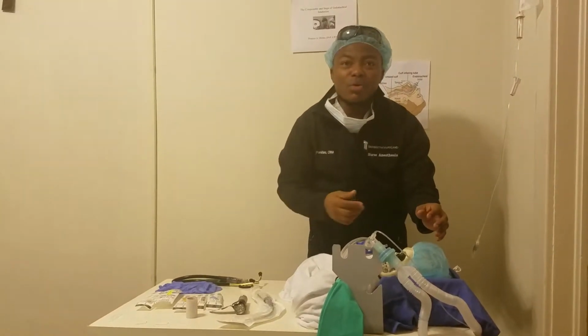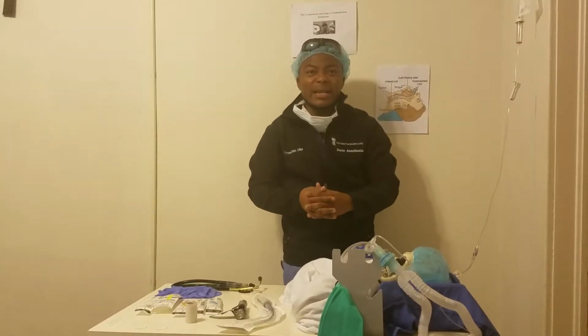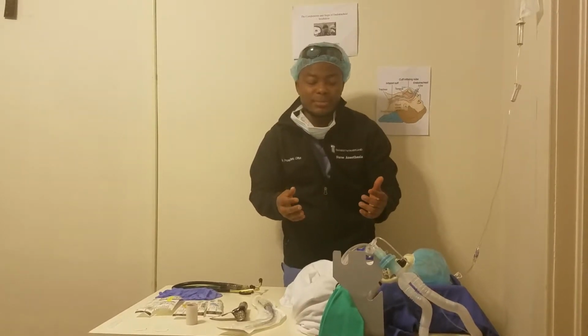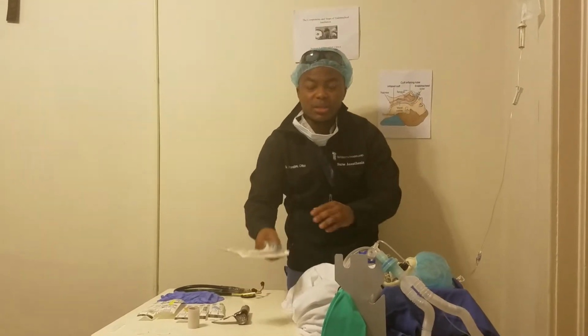Then we give our rocuronium or succinylcholine muscle relaxant and wait either till we see fasciculations or we wait for 90 seconds for the drugs to actually kick in appropriately. Once that's done, we get ready to intubate.